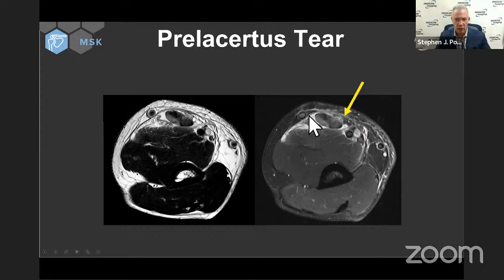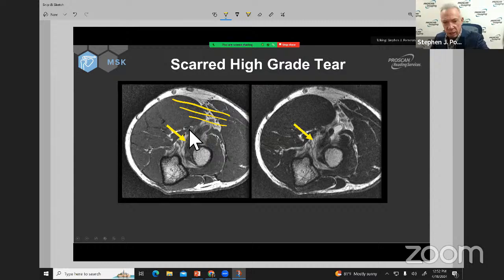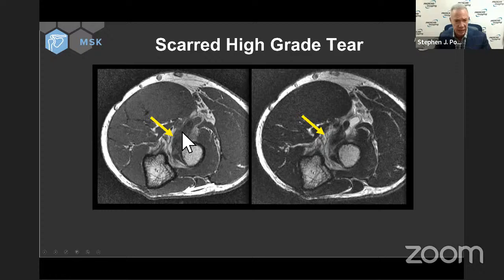Here's a 65-year-old complaining of elbow pain going into the forearm. Here's a slightly different type of injury. This is somebody with diffuse tendinopathy, but that's not all. I mean, look inside the tendon. Remember we said the tendons consist of subunits. Subunits are parallel to one another. Look at how disorganized, on the T1 and on the T2 weighted image, the interstitium of the biceps is. So it would be really improper to call this tendinopathy. It's more appropriate, because of the loss of the internal anatomy, to call this a scarred interstitial tear. And then look at that defect right there. There's also some substantive tendon loss.